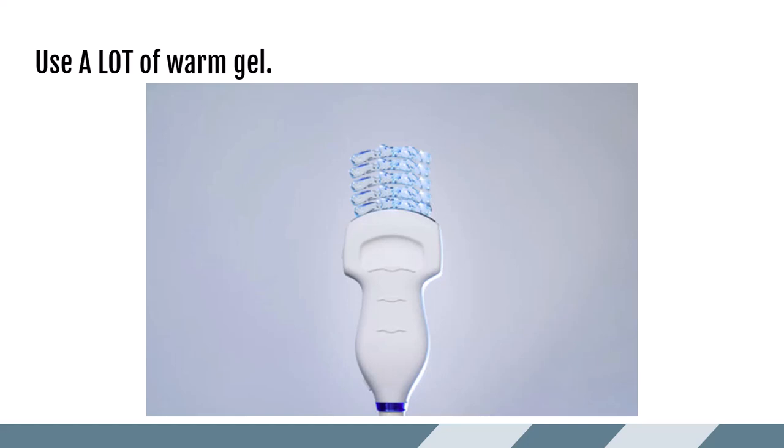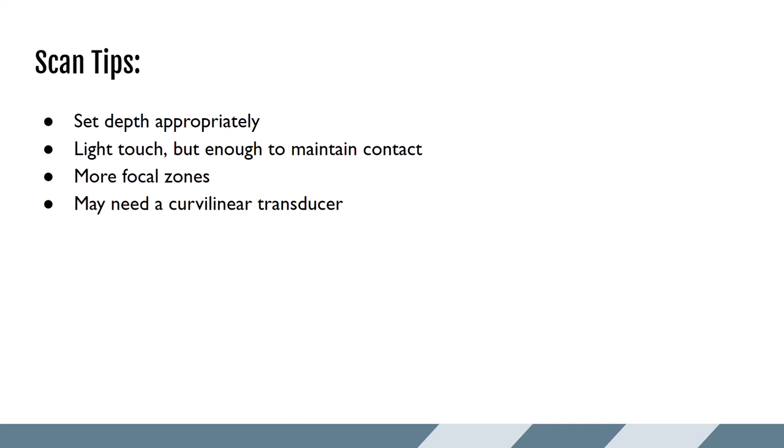You also need to use enough gel to remain in contact with the testicles. You've got a flat transducer surface trying to contact rounded structures, so more gel helps with that. It also helps eliminate air in the skin folds of the scrotum. Set your depth appropriately — increase depth so you can see just past the posterior portion of the testicle. Use a lighter touch, but still enough pressure to maintain contact across the whole testicle without dropout on either end. More focal zones can improve lateral resolution since the testicle is non-mobile. Have a curved linear transducer nearby, as high-frequency probes may not penetrate through more swollen or larger scrotums.